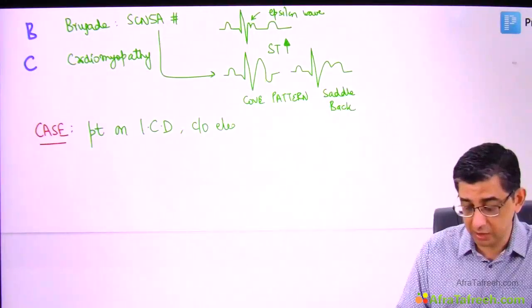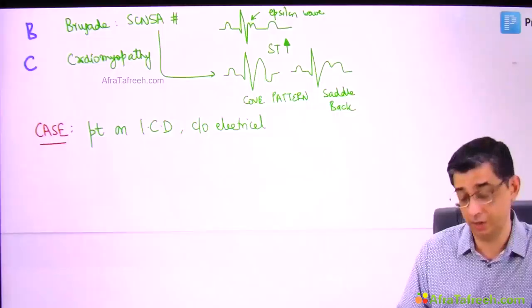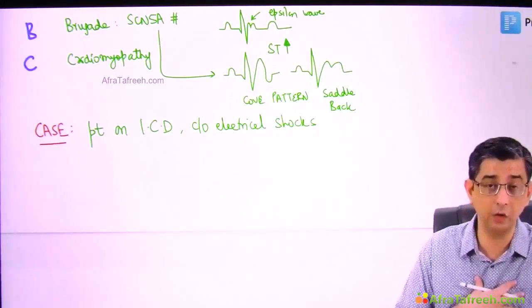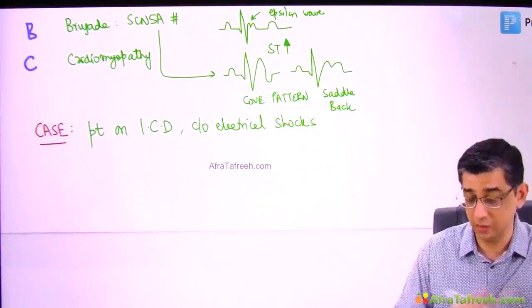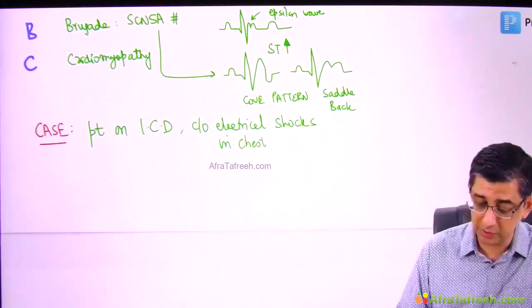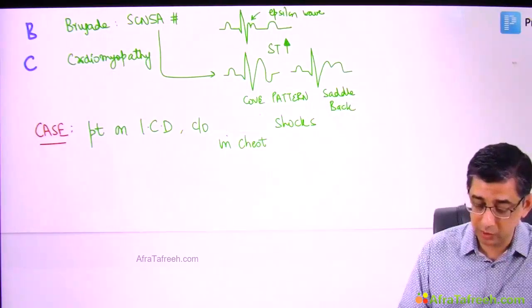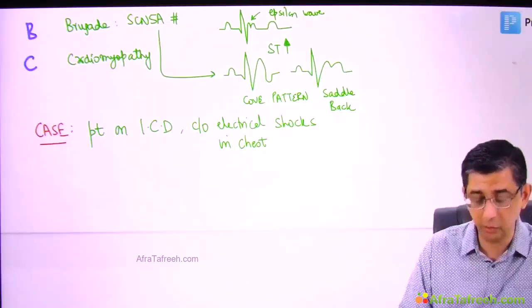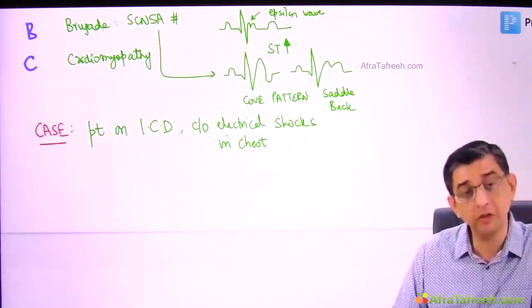First, I thought, does this guy need a psychiatrist? I mean, what is he talking about? He's saying, sir, electrical shocks are going on in my chest. I can feel contraction of my chest muscles. It hurts also. So initially, I was very surprised by the complaints of this person. But since I know that this person already has an implantable cardioverter defibrillator, he himself told, patient on ICD, complaints of electrical shocks in the chest.